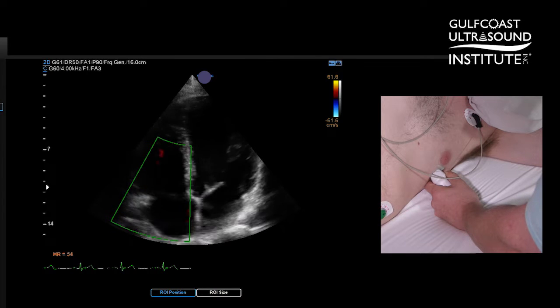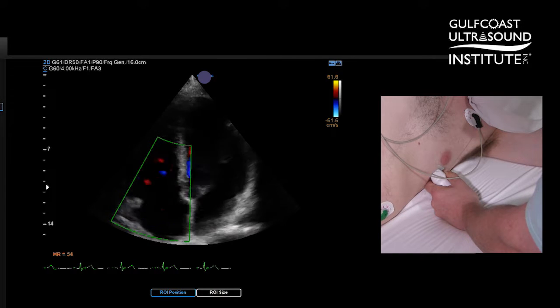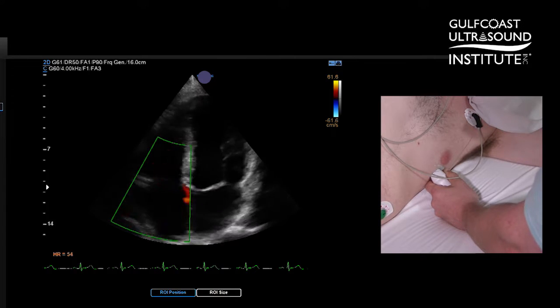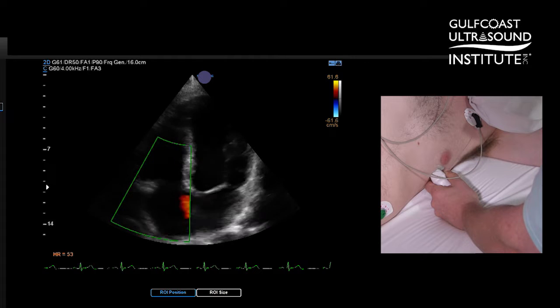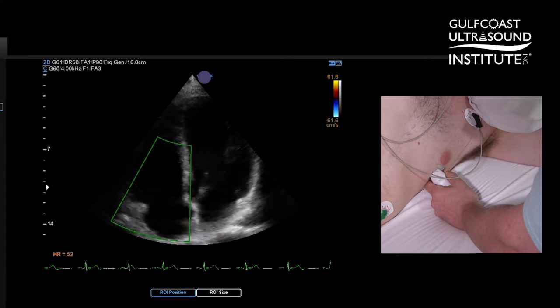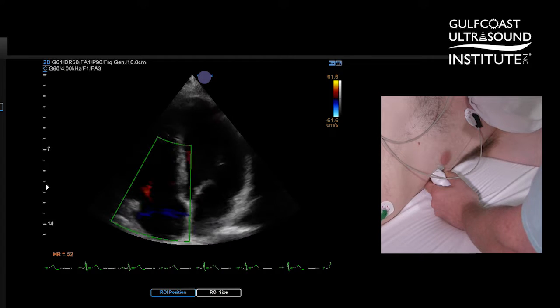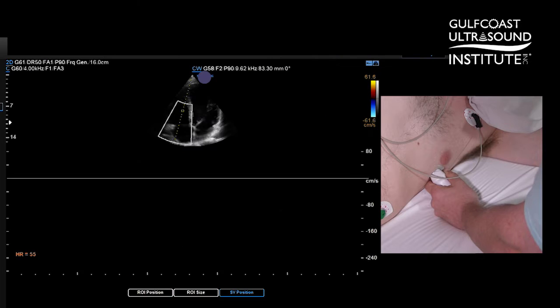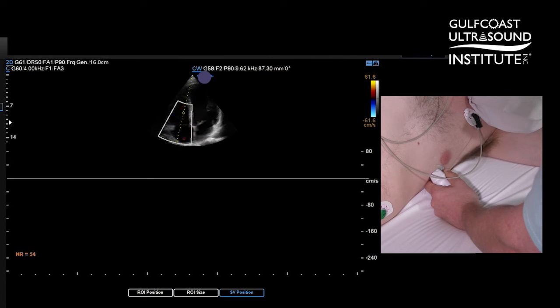You can see not a lot of tricuspid regurgitation. The image is a little dark, a little hard to see if there is anything there. I'm going to try my continuous wave Doppler here.